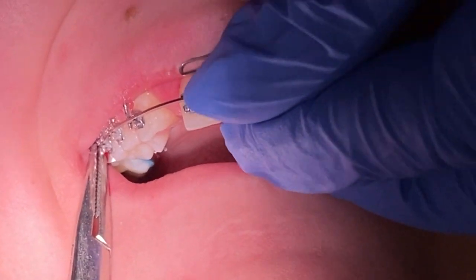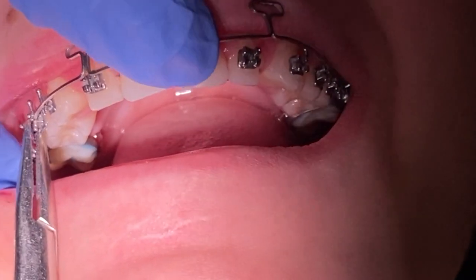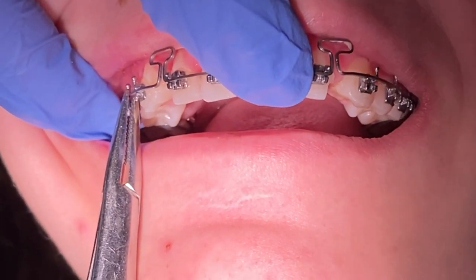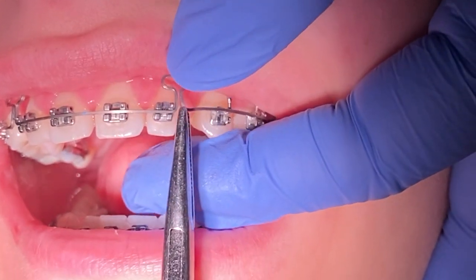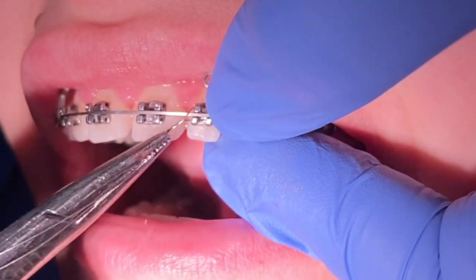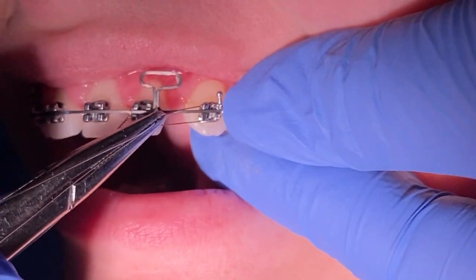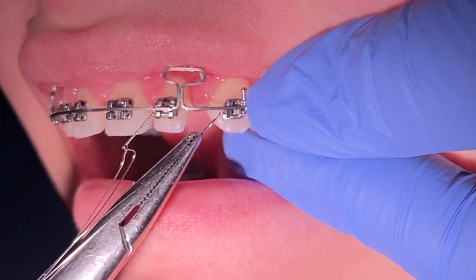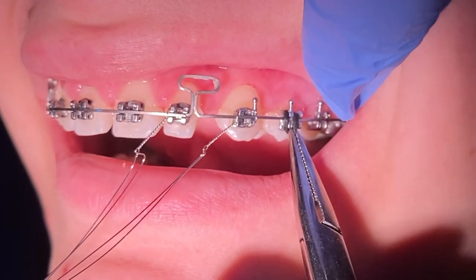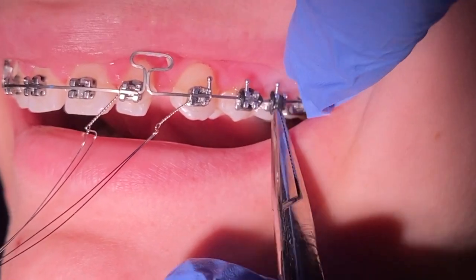This is a very difficult wire to place — the insertion into the molar band is a bit tricky, as you can see it's being stubborn and not wanting to go into place. Just be patient. Once the wire is placed on one side, the other side is a lot easier to insert. Quite a few ligation ties are going to be placed on this wire, as the wire can try to move in a different direction or shift the teeth at a different angle — we want to make sure it's retained well. If anything is poking you, let your dental professional know so they can clip or tuck in those ligation ties.